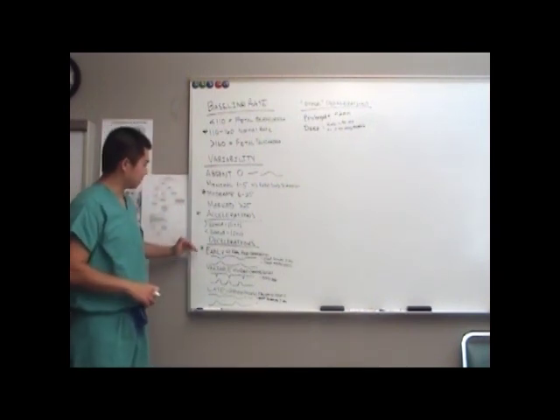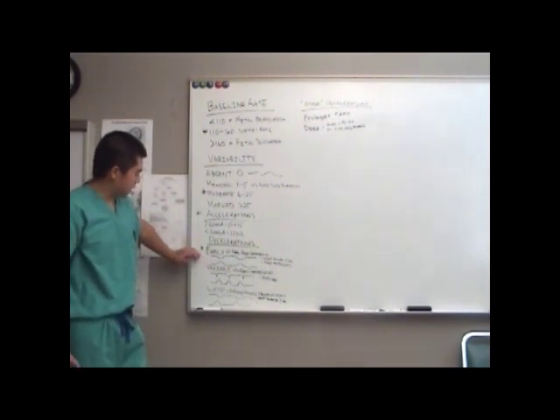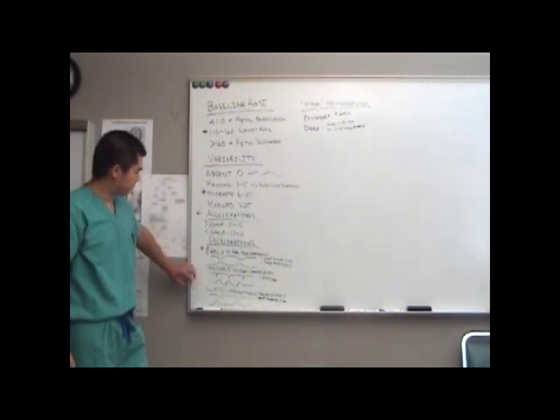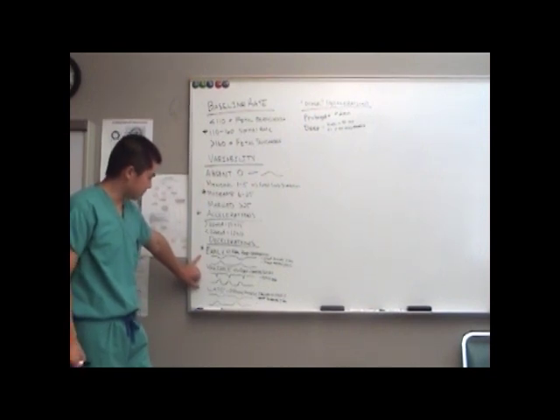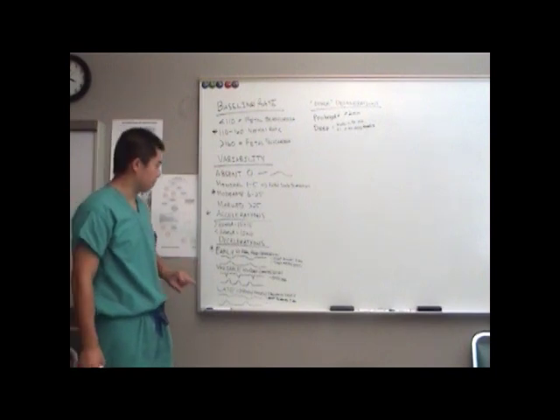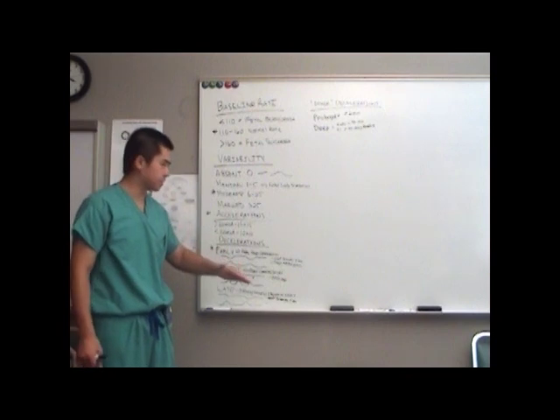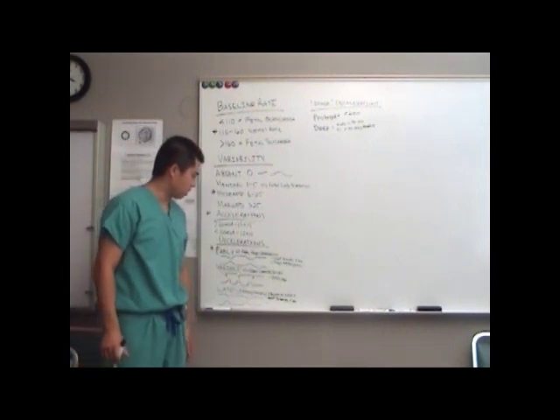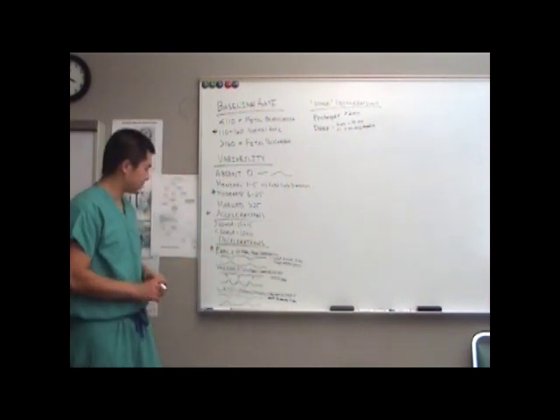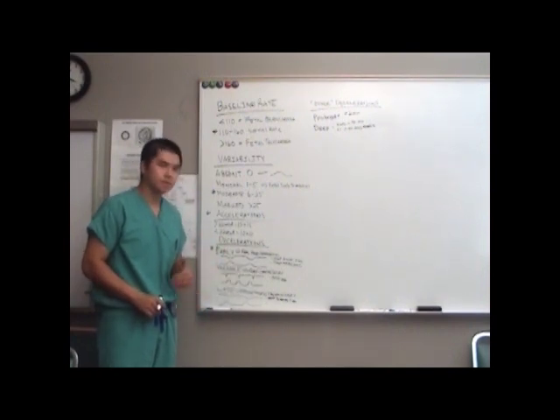So going back to our decelerations, what do you notice about the definition of early and late decelerations? Is there a time component requirement for early or late decelerations? No, there is no time component requirement. The only requirement is that it's gradual, so it takes about 30 seconds for it to drop to its low, and then a different definition in terms of the timing. So whether it drops 5 or 10 or 15, it doesn't matter.